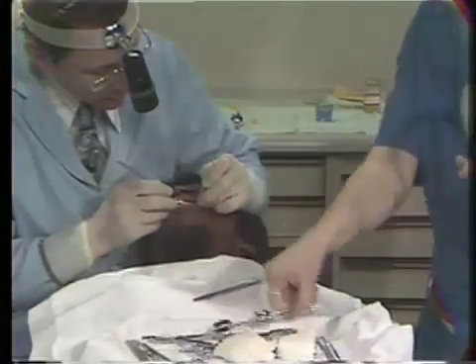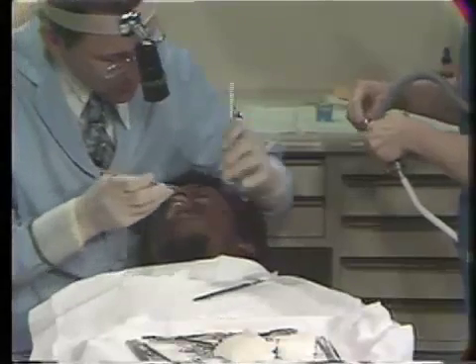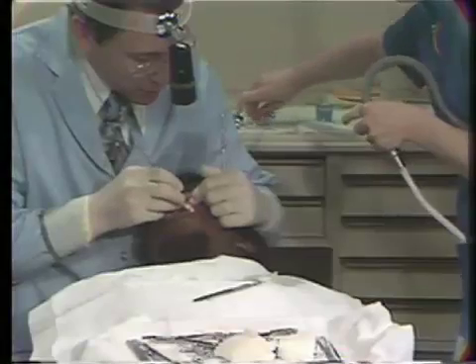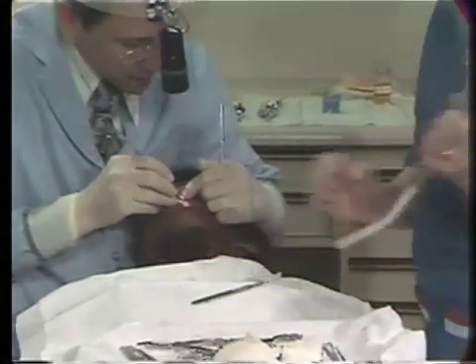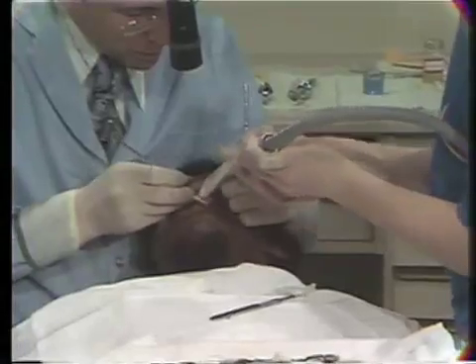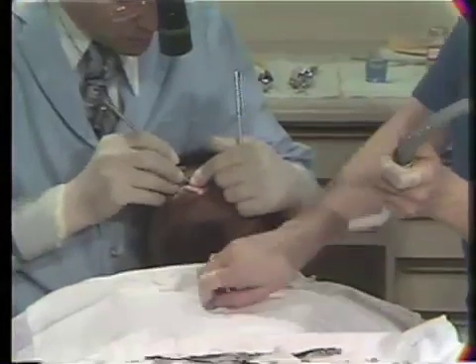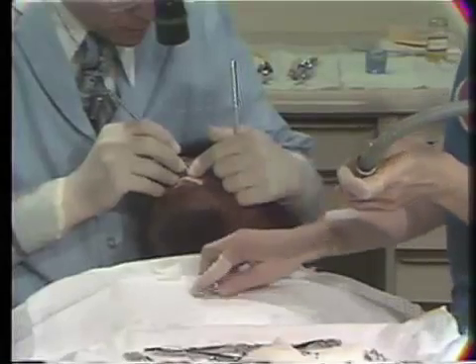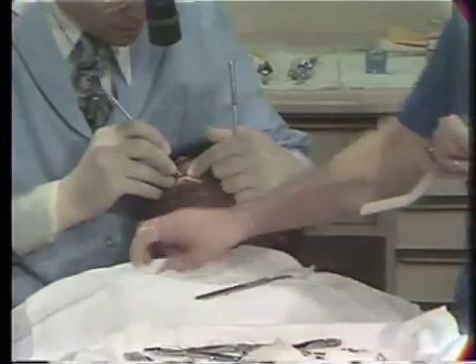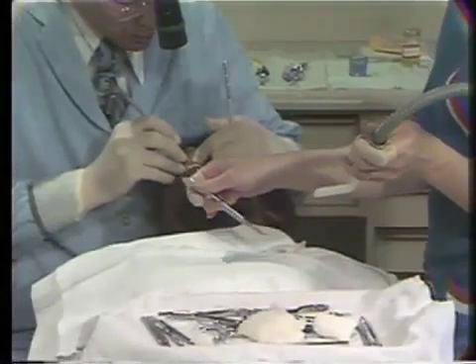And I'm checking now to see if he's numb. Can you feel this at all here? A little bit. Just a little bit? Let me check the outside now. Is there any sharpness out here on this outside? Evacuate, Betty. Let me turn it back off now. You feel anything out here, not here? Good. Now, is this sharp over here on this? Okay, good.